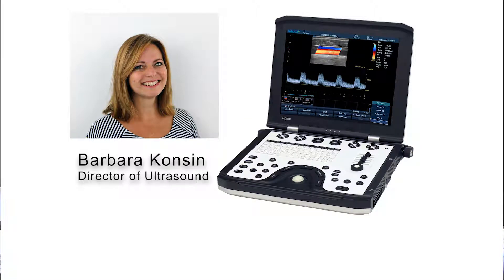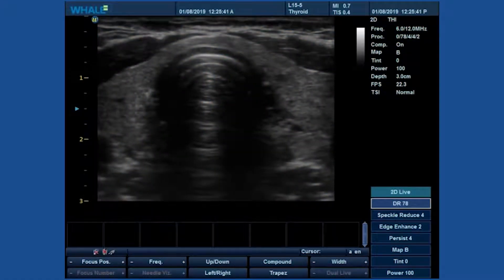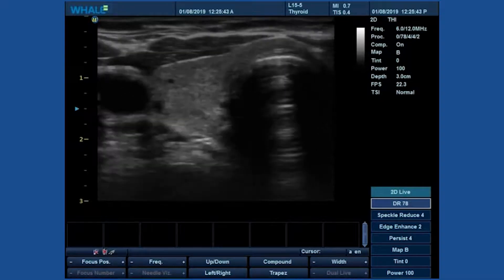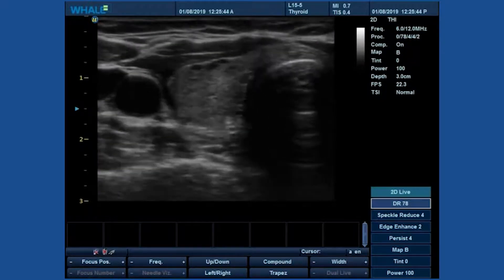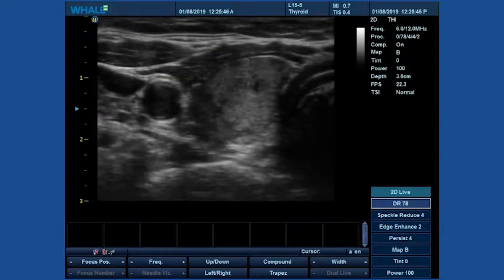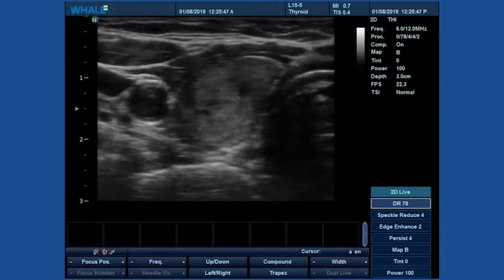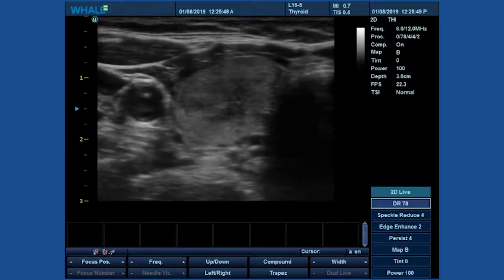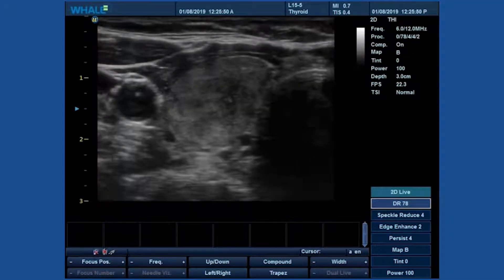I'm going to walk you through the zoom feature on the Whale Ultrasound System. At first glance it may seem very different than ROI zoom, but actually it's still ROI with one less step for faster access.